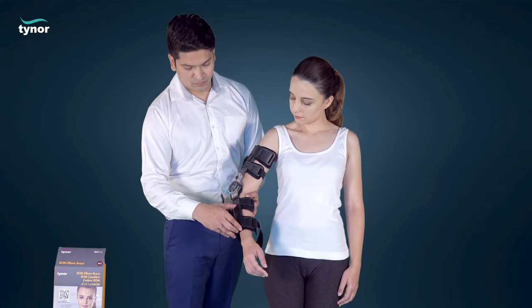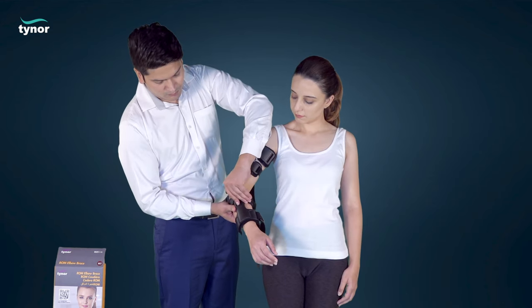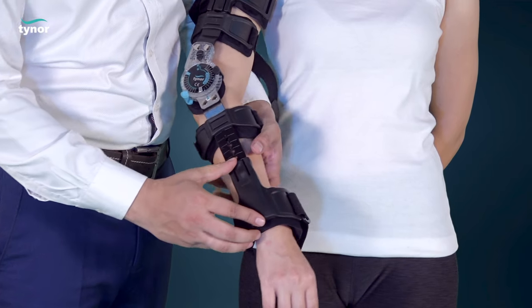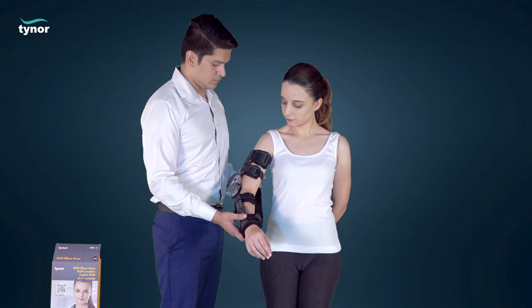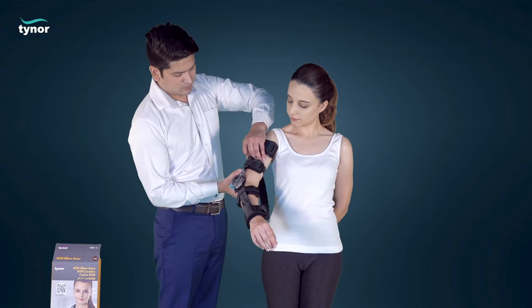Pull the built-in locking mechanism to adjust the wrist cuff closer to the wrist joint. Move the cuff closer to the desired position and release the lock. The lock will engage automatically. Adjust the bicep cuff to the required position and tighten the rest of the straps.